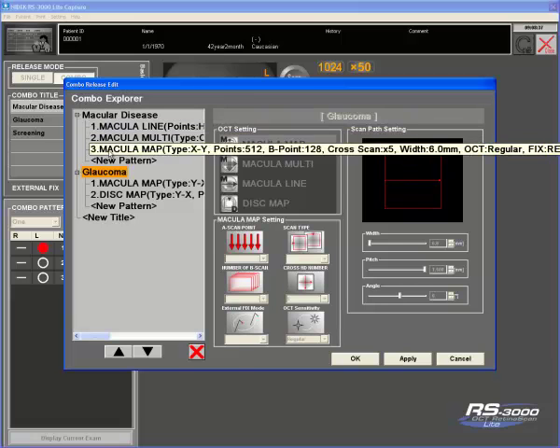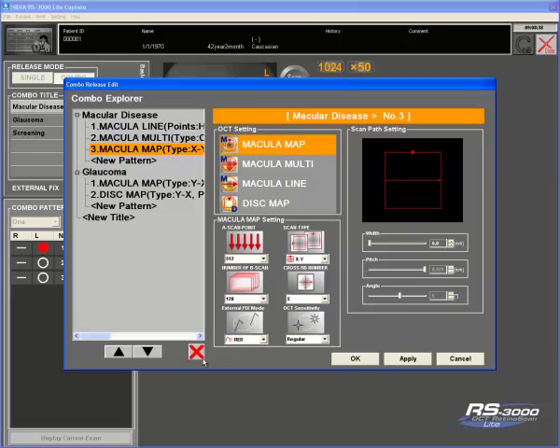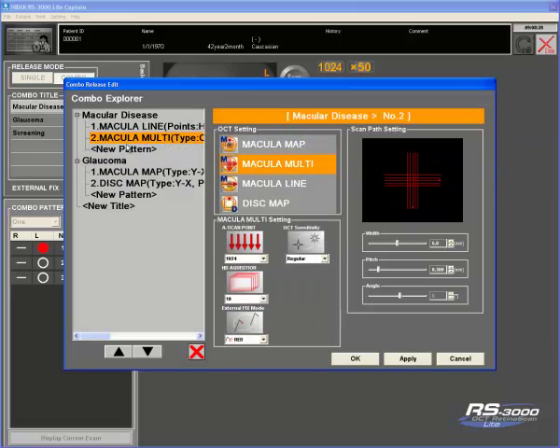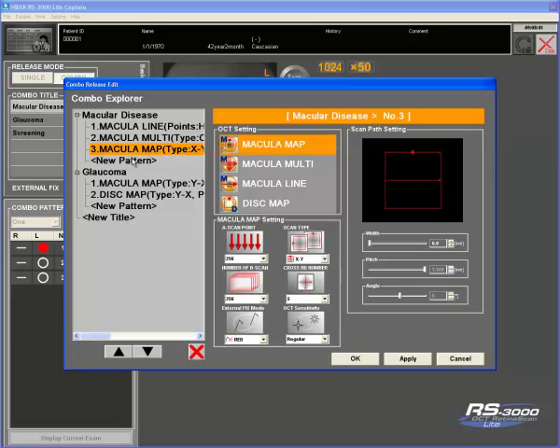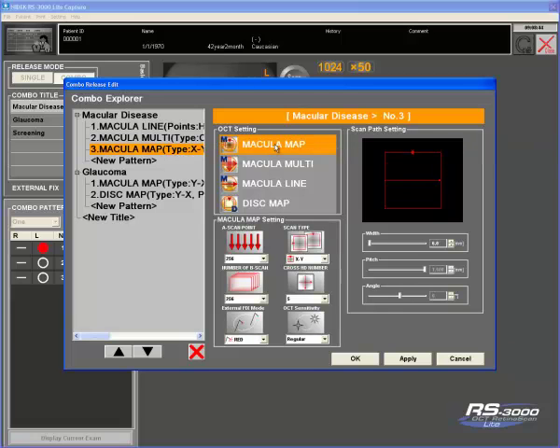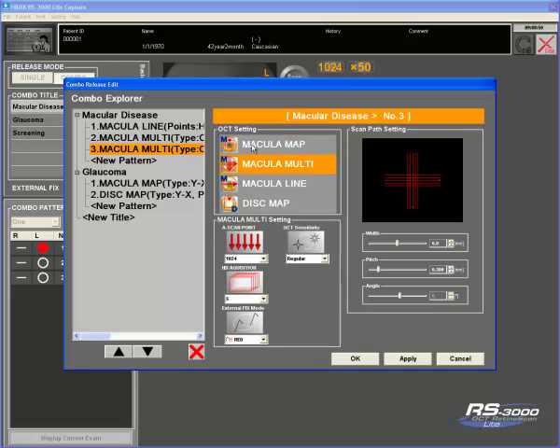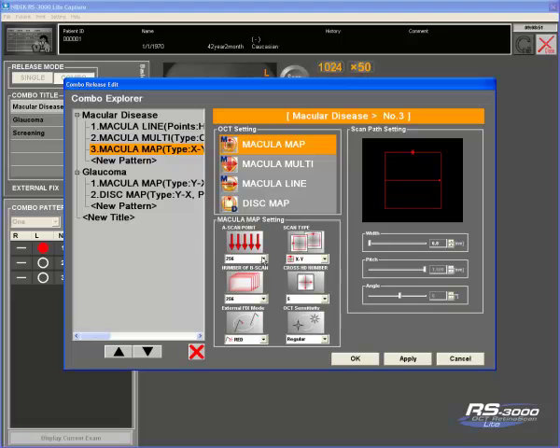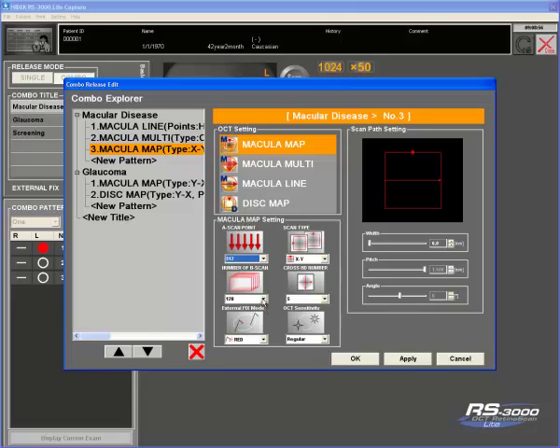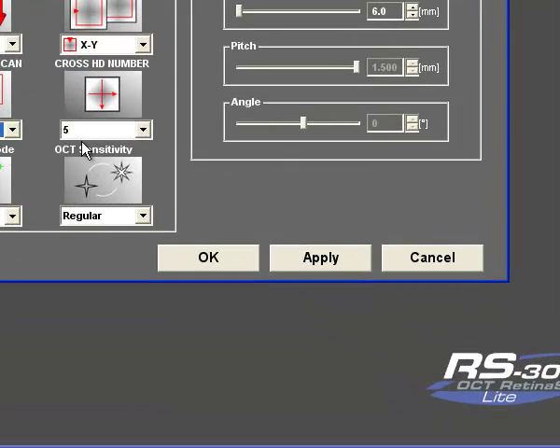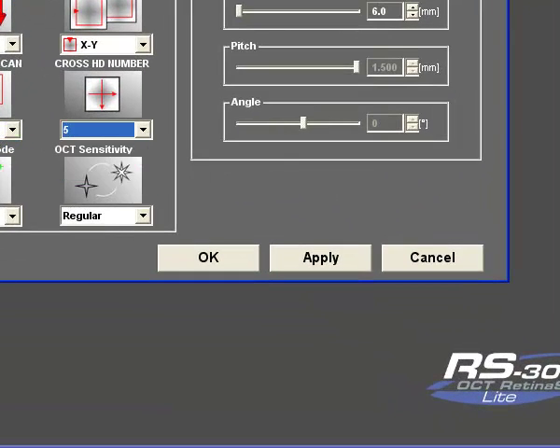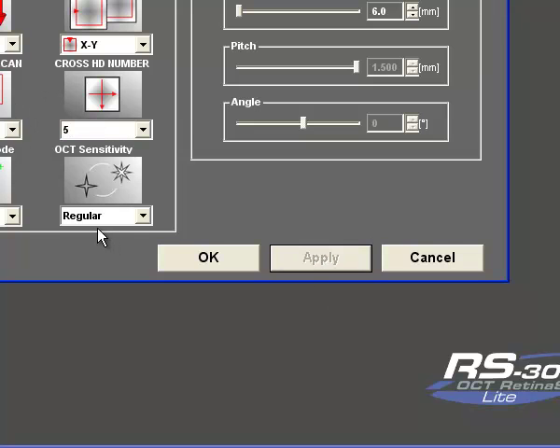To change the scans, you can simply delete them. To add a scan, select on the new pattern. This will then highlight and you can go to this side and select what scan you want, and then you can select the actual settings of the scan. The number of A scans is for your resolution and the number of times each B scan is through, and your different settings for how you want the scan to be. Apply that and that is done.